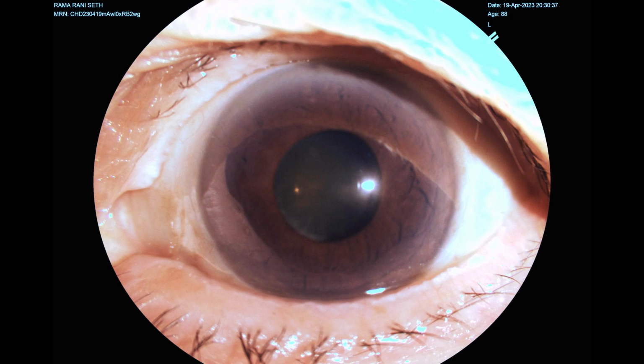In this video I'll demonstrate how to do a phacoemulsification in a patient with poor pupillary dilatation, the kind of pupil which doesn't respond to mydriatics. Although this can be done using pupillary expansion devices, here the aim is to demonstrate it without them.